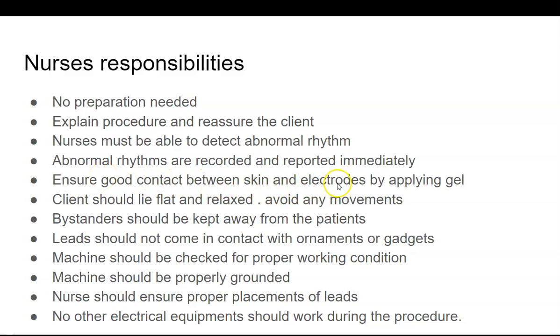Ensure good contact between skin and electrodes by applying gel. You have to apply the gel, but it should not be too little or too much. The client should lie flat and relaxed and avoid any movements. So you should instruct the client not to move around, to relax and to avoid any movements. Bystanders should be kept away from the patient. Usually it's better to keep them away.